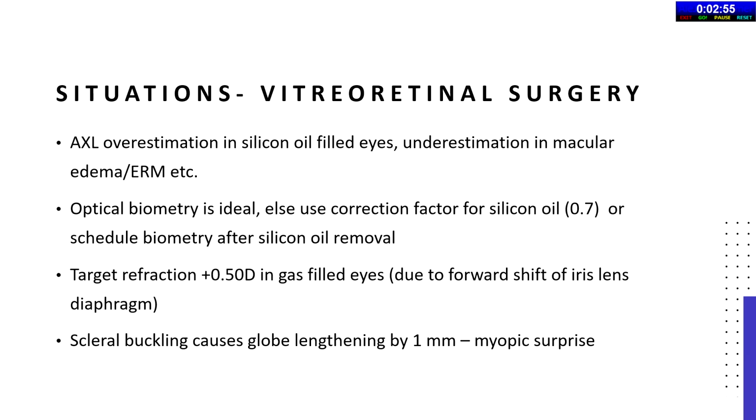In post-vitreoretinal surgery eyes, as Dr. Meena has mentioned, in silicone oil-filled eyes, there is always an overestimation of the axial length, giving rise to a myopic error, and underestimation in patients with macular edema or a retinal detachment. So in these cases, optical biometry is ideal when compared to ultrasound biometry. And in patients with silicone oil, it is also better to do the silicone oil removal and then do the biometry for the IOL power calculation, or consider the correction factor when using an ultrasound biometer.